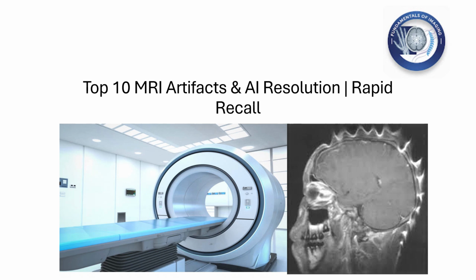And this is the rapid recall. So be with me for about 15 minutes. And this is a very important topic for medical entrance purposes. So be with me and let's begin.